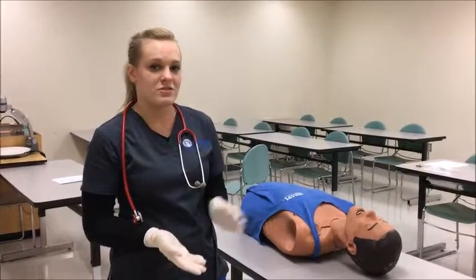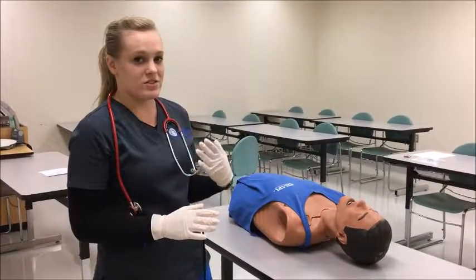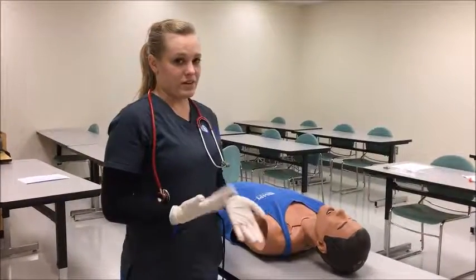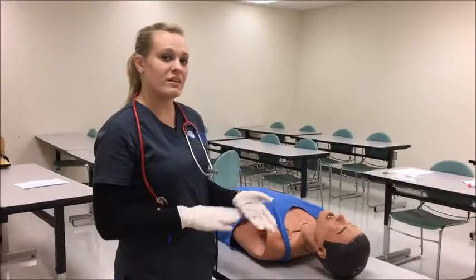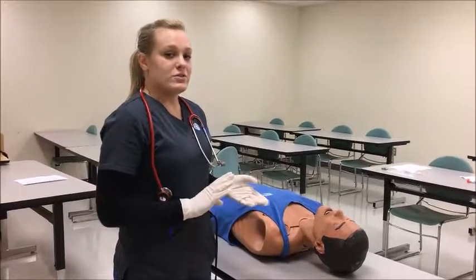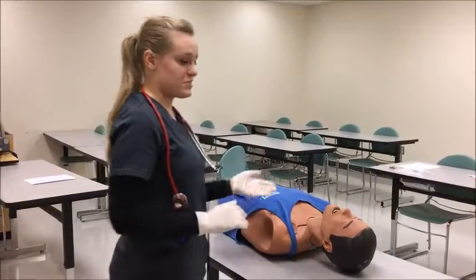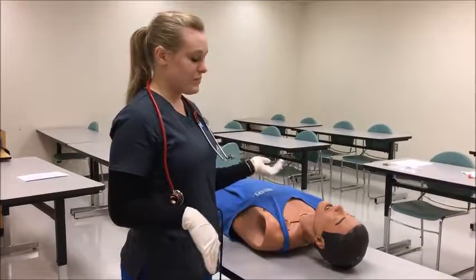Additional clinical indications could be an elevated heart rate, elevated respiratory rate, and the patient's appearance. Our patient today has a little bit of blue in his face, which means he has low oxygen. That is why we are giving him a nasal cannula. Before we apply the procedure, we would do simple vital signs like pulse and respiratory rate. We do their sats using a pulse oximeter, and we assess the color and level of dyspnea. So his color is a little blue, and he's having increased work of breath.